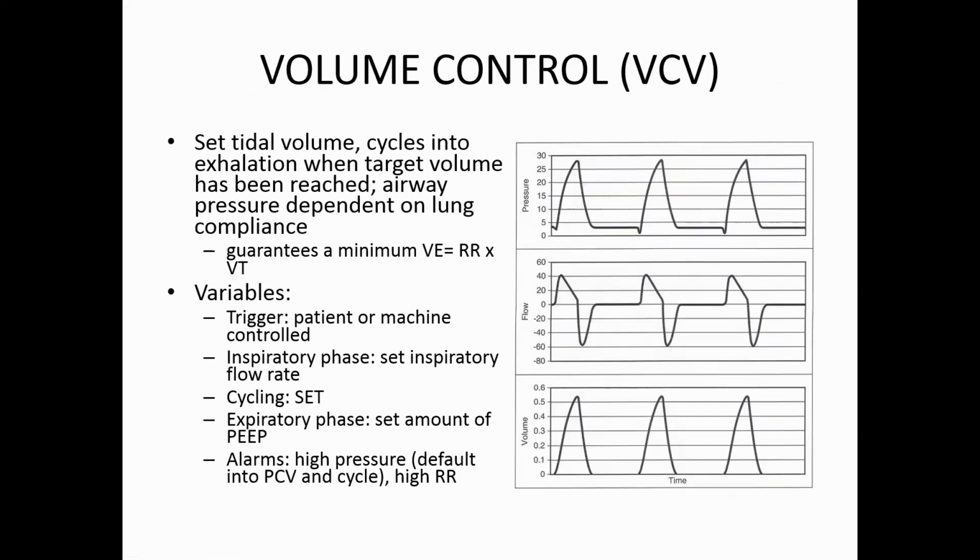So in volume control, you see something like this. Whenever you go to the ventilator, you need to look at the scalars, which will show you the pressure, the flow, and the volume. The least important perhaps is the volume, unless it's changing too much and then you end up with a problem. But focus on the flow and on what's happening with the pressure waveform. So this person, on every single breath they're taking, at the initiation of inspiration, the pressure is below the baseline, which means every breath here is being assisted by the patient.